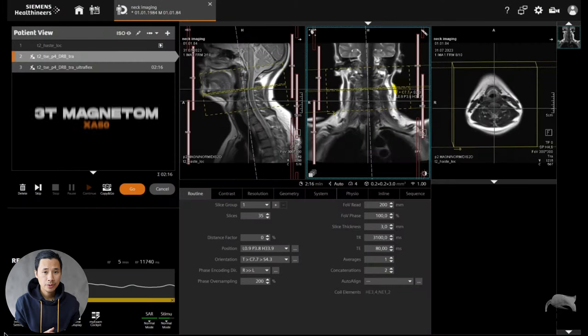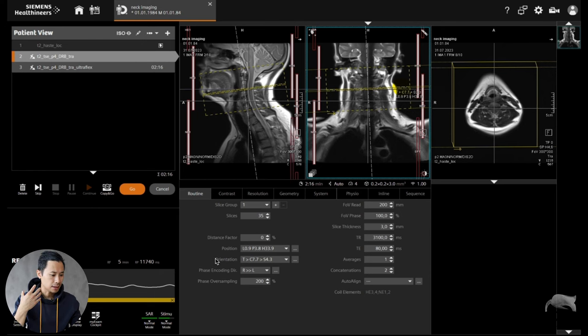One image was a little bit reduced — not good — and the other one was much better. Let's go to the scanner and I'll show you what I did. Currently we are at 3T, but it doesn't matter, it should work on 1.5T as well. I never tried it, but you can see the impact, so it should work. The first thing I did was use a standard coil setup without the ultra flex — only the head coil and the neck coil.